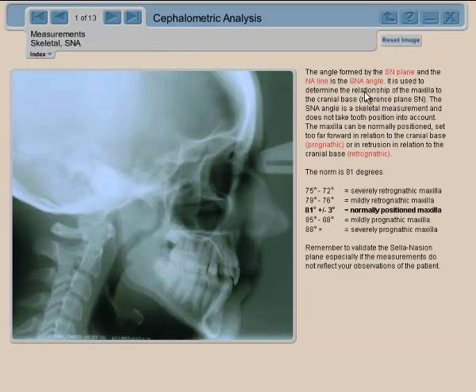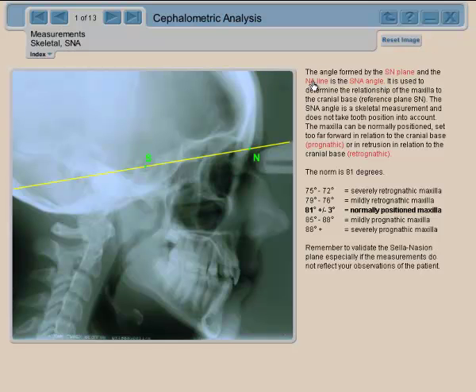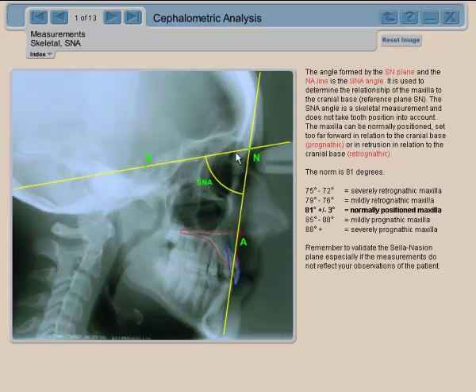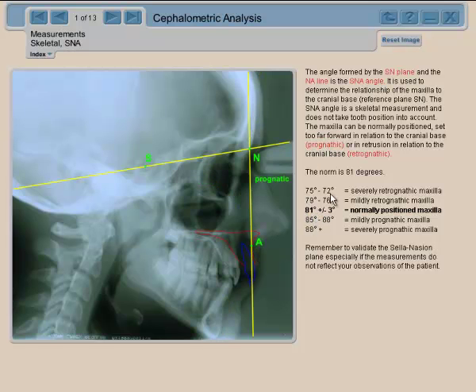Let's look at SNA. We have determined some points and we know the plane — this is the reference plane. We trace the NA line and we have the SNA angle, which is the junction between SN and NA. It gives you the projection of the maxilla in relation to Steiner's reference plane. If the SNA is larger than the norm — which is 81 degrees — you have a prognathic maxilla.